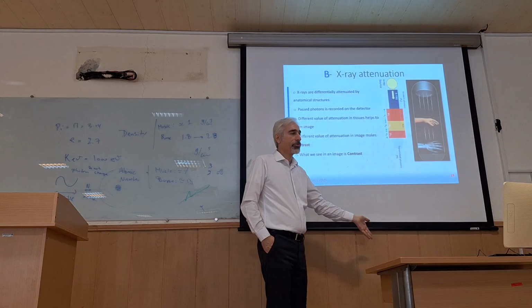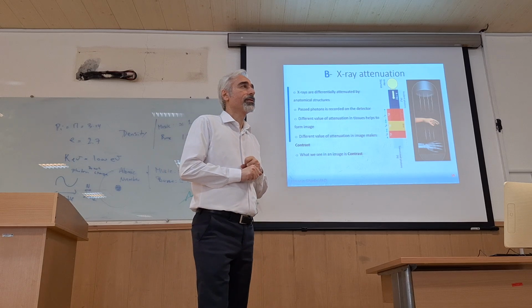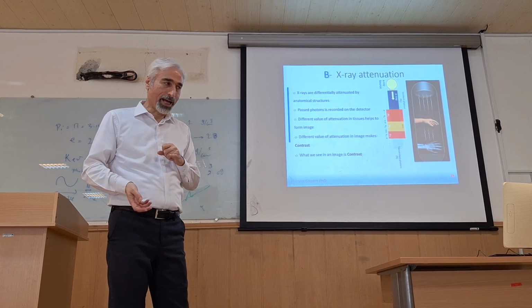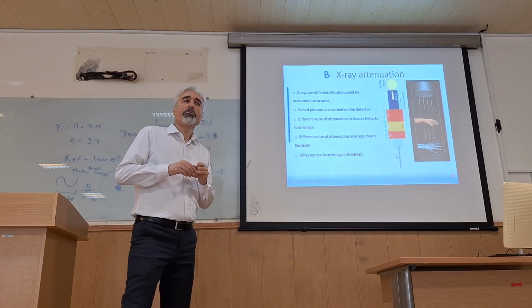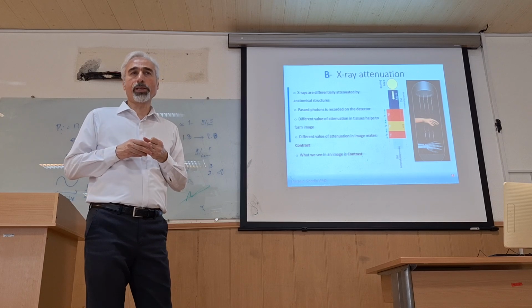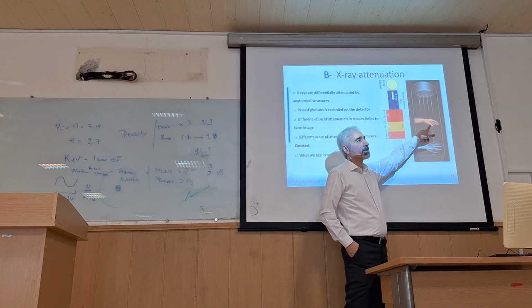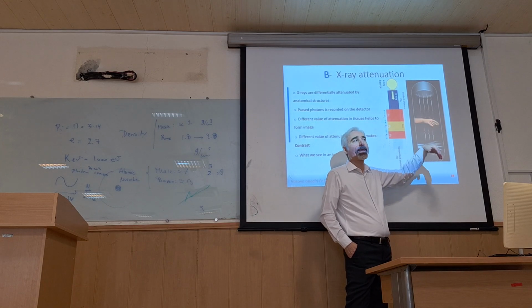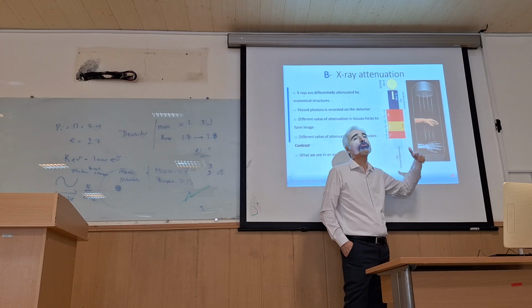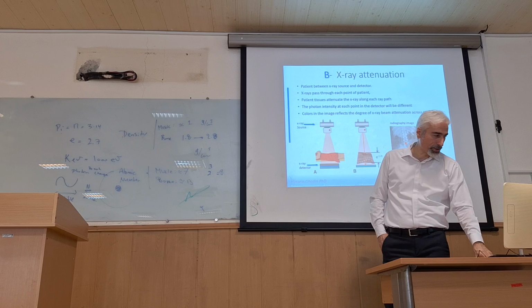And here, as a summary, we can say that as X-ray is sensitive to the value of density and atomic number, and we have different density and atomic number at different points of the body, we have different amounts of photons passing through, and then we have different colors in the shadow, so we have an image. This is the chain of X-ray imaging.